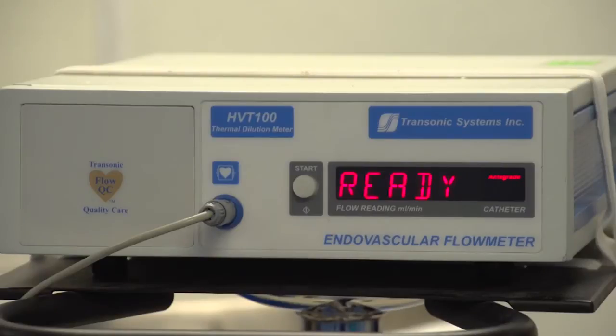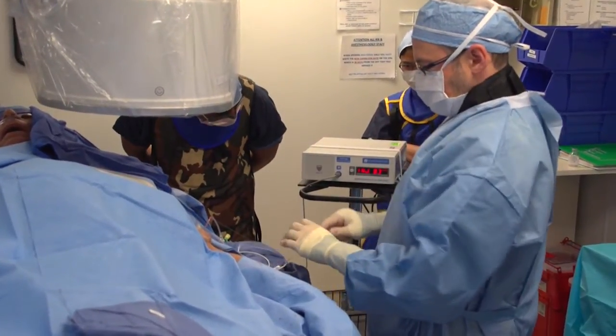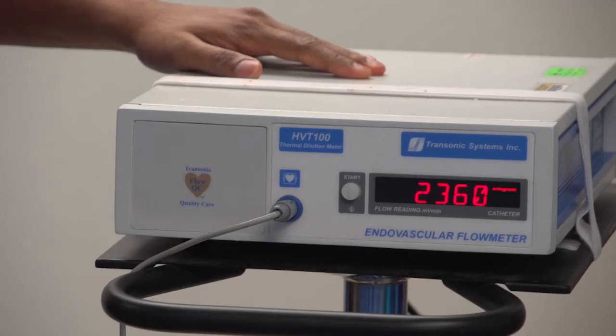We always start with an initial flow rate. I get access in both directions, get my flow rates, and figure out where I'm going to do the banding. If the flow is two and a half to three and a half liters per minute, my usual target is to slow it down by about 50%. On a high-flow fistula I might start with a 4 mm intraluminal balloon. If I've only achieved 30% reduction, I'll try a 3.5 mm or 3 mm balloon, staging it and checking flow measurements between each incremental change until I achieve about 50–60% flow reduction.